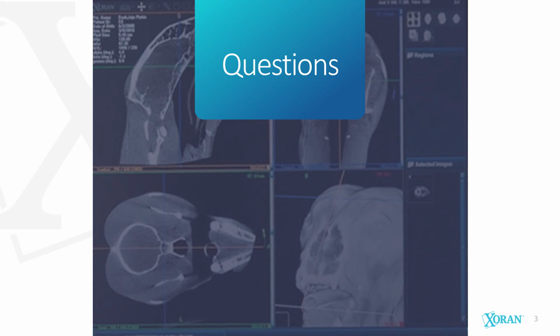So the secondary question from Dr. Hiscox, I think, is related to this, whether there were any issues with moving it around within the hospital. Well, it goes through a regular doorway, and it rolls quite easily. And it's got little locks when you get it where you want it to be. I've even got some sills in some of my rooms, and it bumps over there, and it's quite happy.